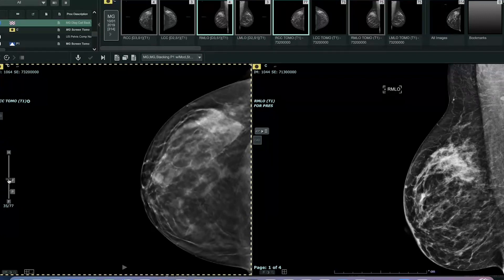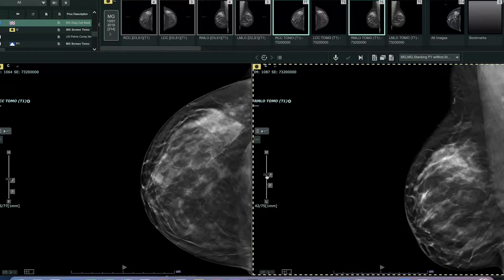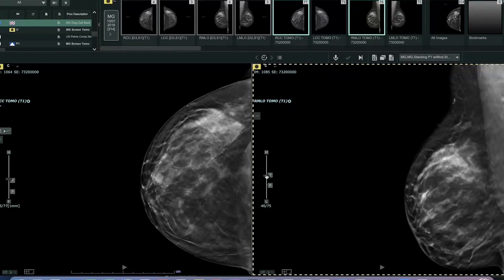As I scroll a little bit further, I see an oval circumscribed mass near the nipple, kind of behind the nipple. These two findings are not well seen on the 2D mammogram version of the MLO view, but when I go to the tomosynthesis images, I can see in the inferior breast there is a subtle area of distortion — those lines radiating from the more mass-like area that we see better on the CC view. Near the nipple, we see an oval obscured mass here.